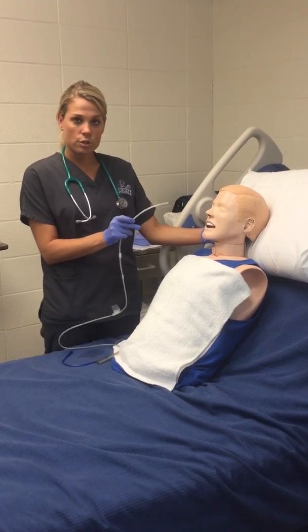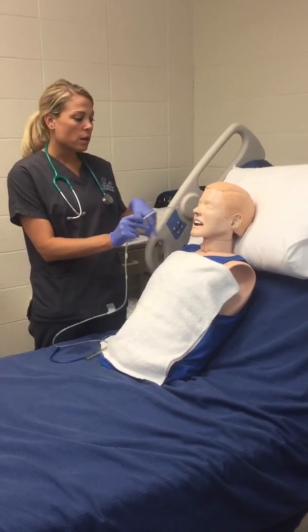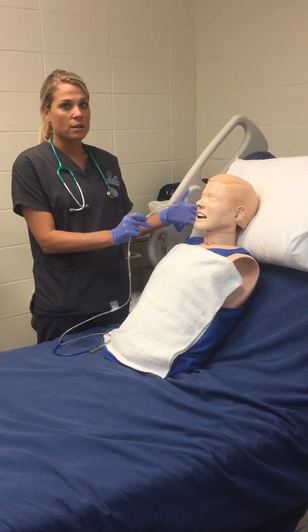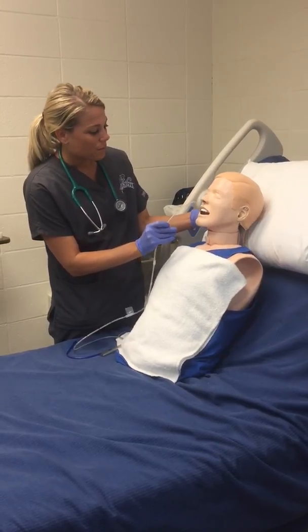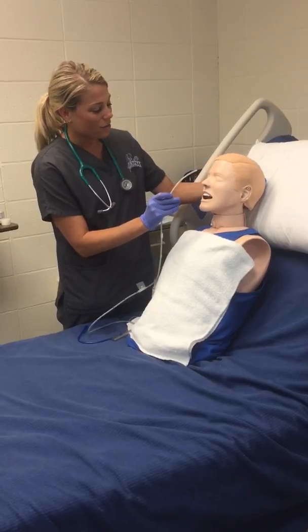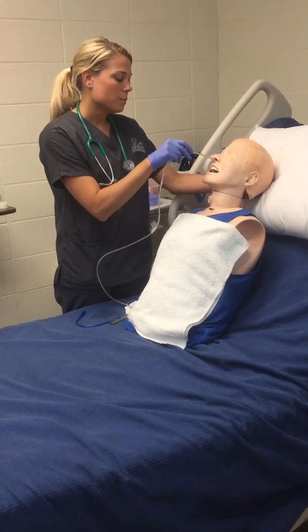we're going to insert the tube, and by doing so we're going to go along the bottom of the nasal cavity past the floor area, and then we're going to direct it towards the ear on the same side as the nostril we're using. So I'll have the patient hyperextend his neck. For video purposes, we have to do it for the mannequin. And then going down towards the ear.